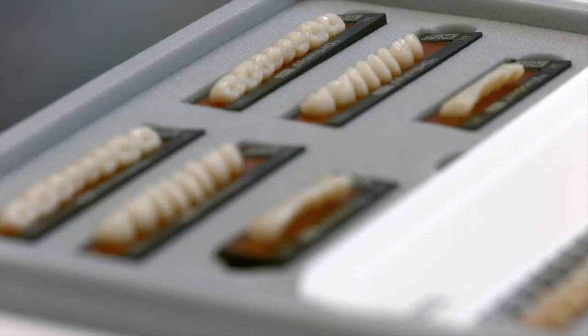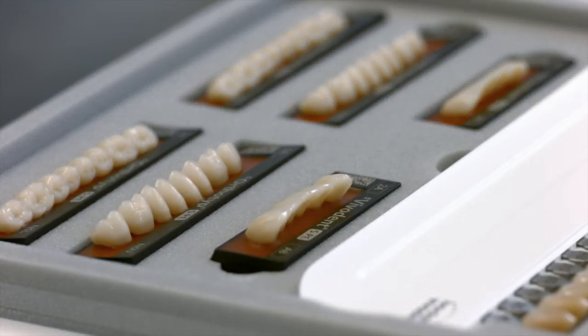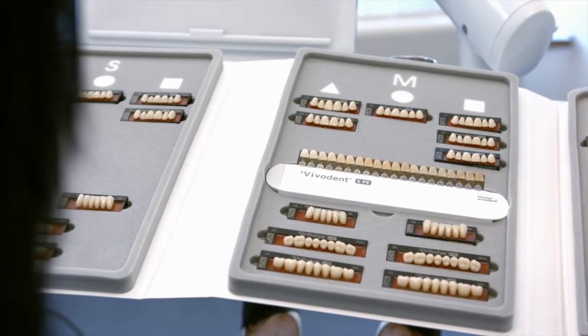The tooth mold chart also assists you in selecting the appropriate size of posterior molds to match the anterior ones. This range of choice enables you to consider and meet the functional and aesthetic needs of your patient.